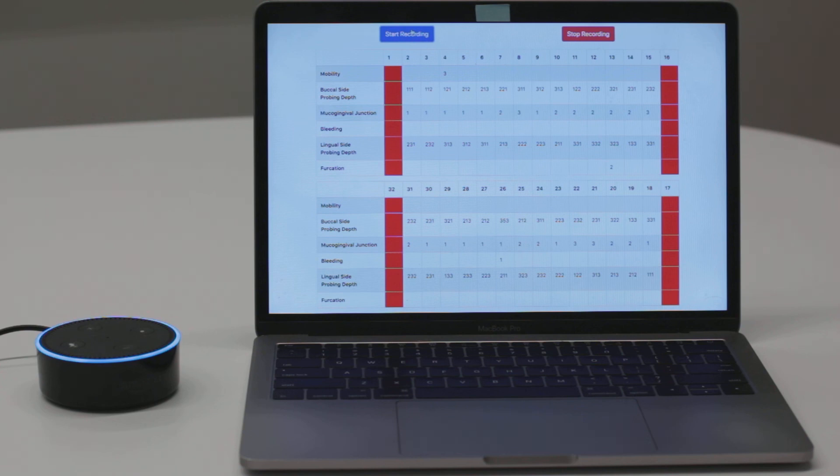Is there anything else that you'd like us to help with? No, thank you. All the values have been recorded. Thanks for using Bola Dental. Have a nice day.